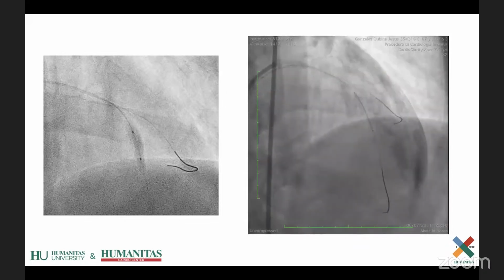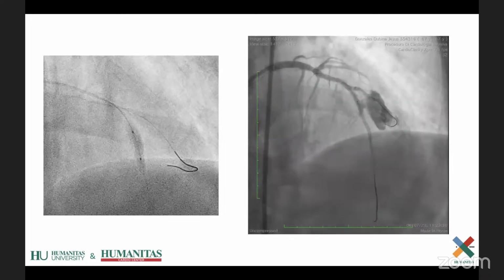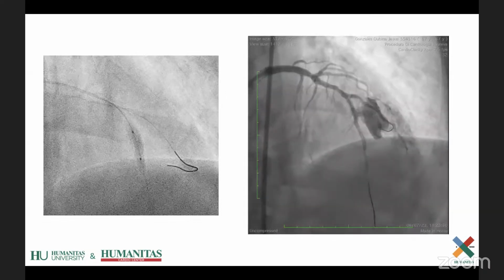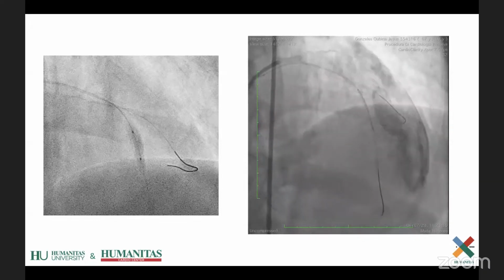Yeah. I just want to tell you, I'm glad that you have that picture. I wanted to tell him before I didn't get the chance. Once you see the balloon like that, the taper down and the expansion proximal, just get your covered stent before you deflate this balloon, because this is a sign of rupture there.